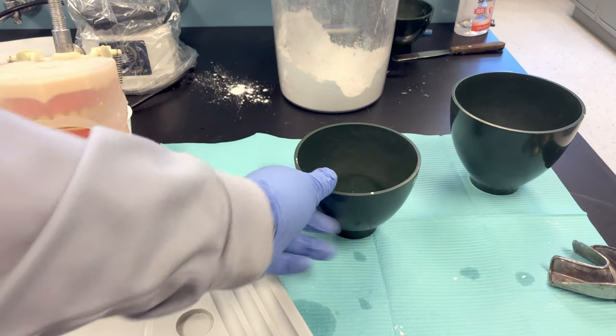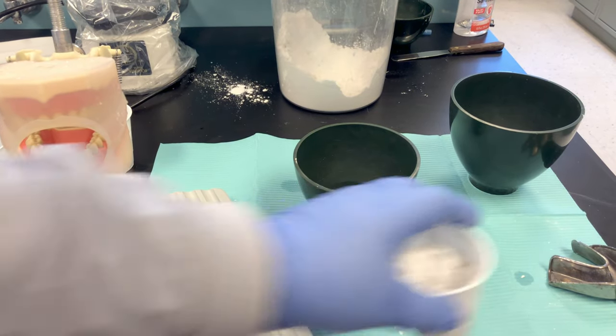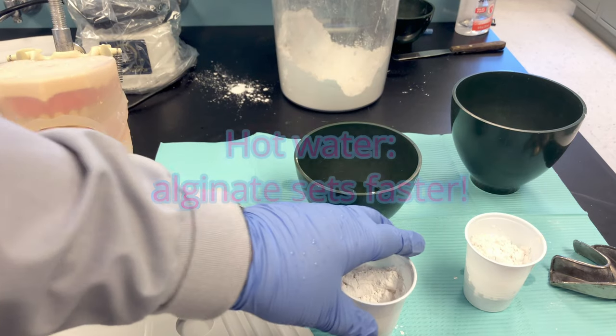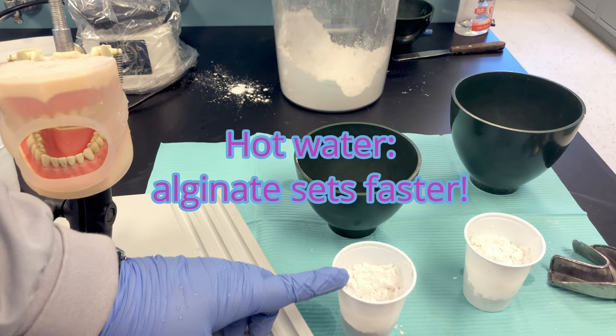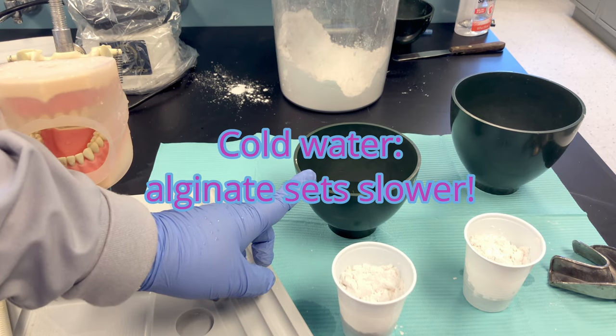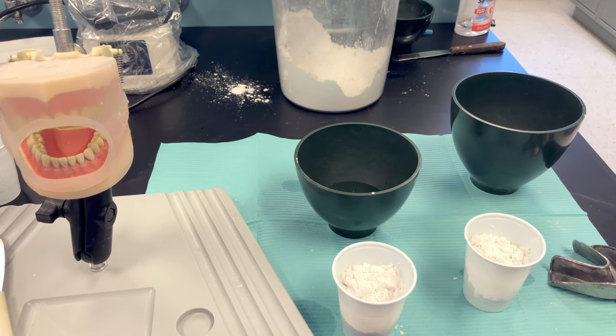For best results, use room temperature distilled water. Alginate is temperature sensitive — if you use hot water it will set up faster and you'll have less time to mix. If you use cold water it will take longer to set and you'll have more time to work with it.